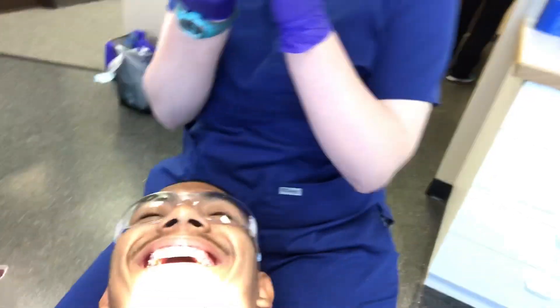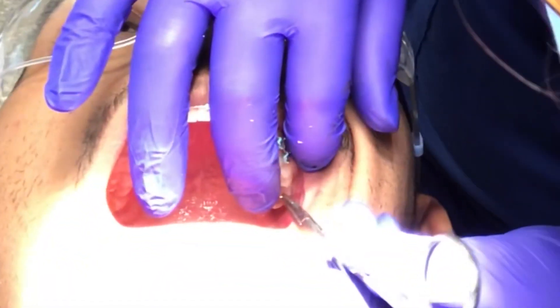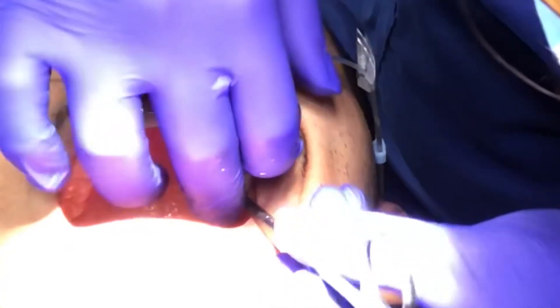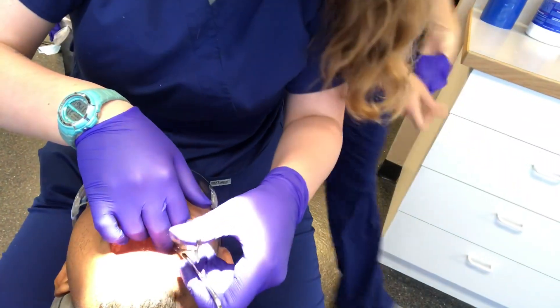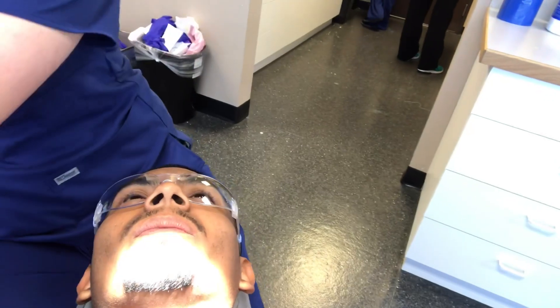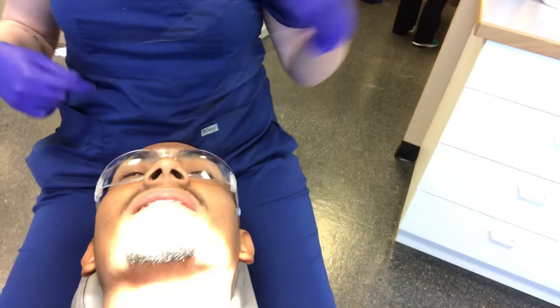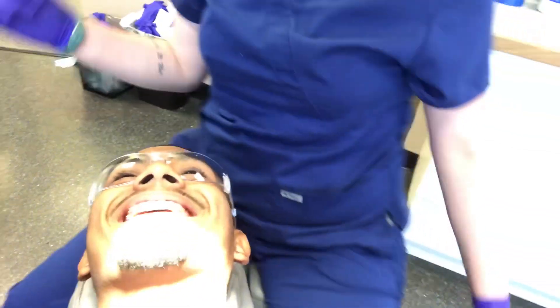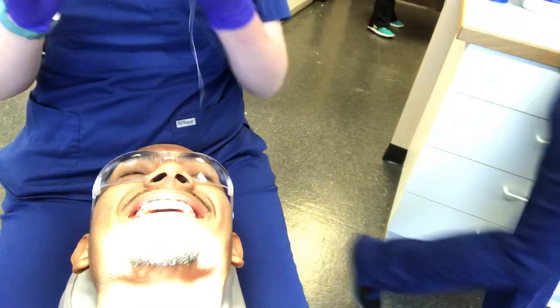I feel like the top are going to be worse, I don't know why. This one does have a little filling back here, so it might cause us a little issue, but we'll see. I'm probably going to use that metal one back there. You're going to feel me push a little bit. That's it. Metal ones are much less painful than those. Ironic, right? Because when you heard metal, you were like, wow. Yeah, I kind of freaked out.